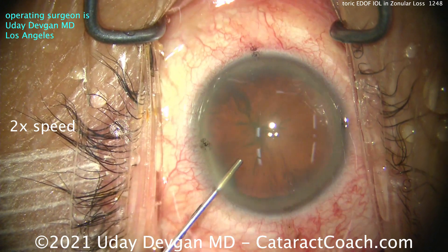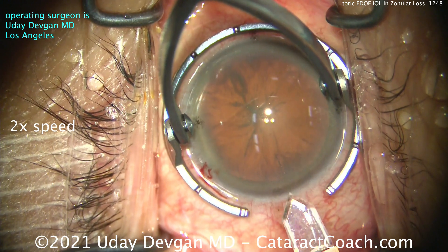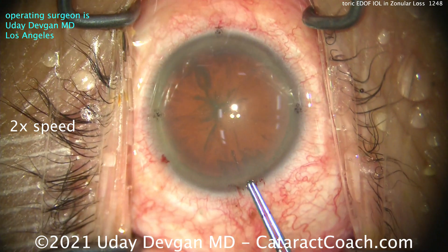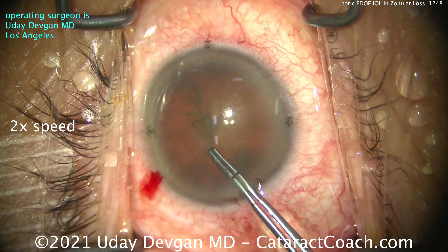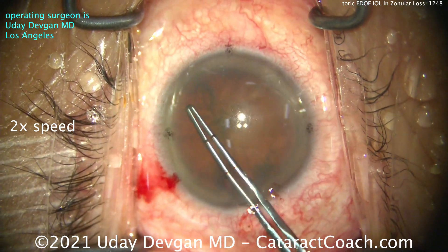Here's the case. Putting in viscoelastic, expecting a normal case. We'll make our main incision. Everything else looks pretty routine, and here's where I figure out there's an issue. We start to make the rhexis, and look at the anterior lens capsule — I poke in, and it's wrinkly. The whole nucleus is moving. Now I know I'm in trouble. That's going to be a tough case.